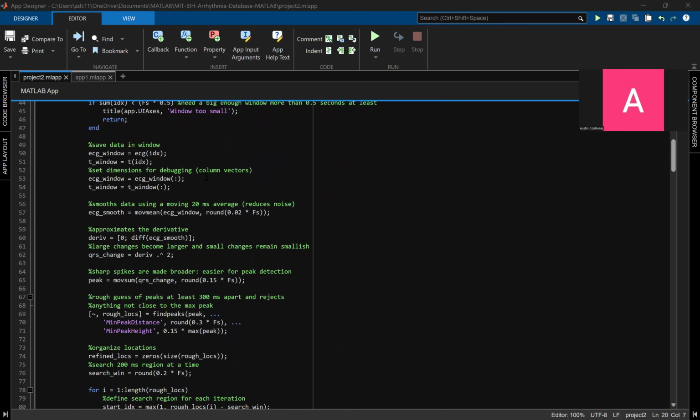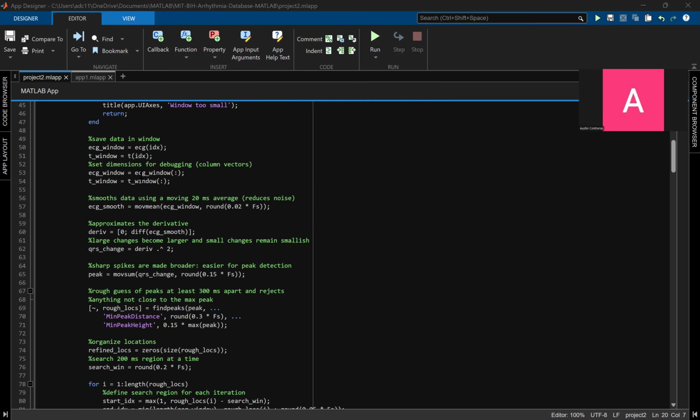I had issues with the array dimensions. The derivative was being calculated as a column vector, but the ECG window and T window were being saved as row vectors or just regular vectors. So then I had to change that using the columns.